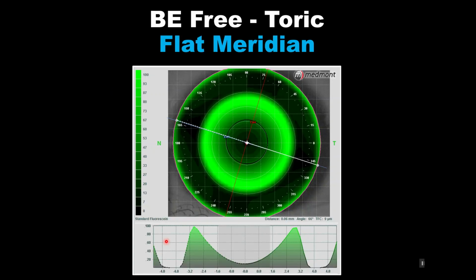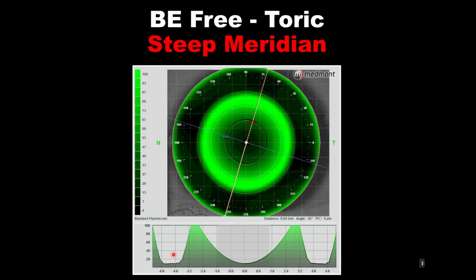Well, let's go back to the software, and instead of using the Symmetric, which really was a poor choice anyway, the software was telling us you'd have terrible alignment. Let's build the lens so that we have the landing across the flat meridian of the eye, landing at 3 and 9 o'clock. Then across the steep meridian, let's create a depth that will give you near alignment with the eye surface.